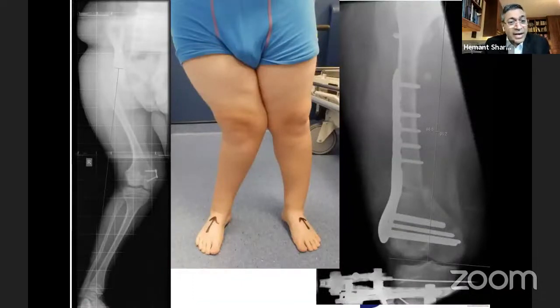We were quite worried, so we did the release of the nerve. This is a fixator assisted correction, and we still use the frame because if there are any minor problems, we can always compensate in the tibia.